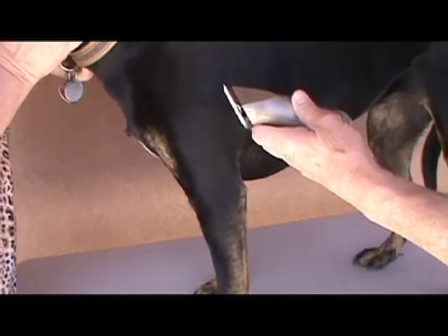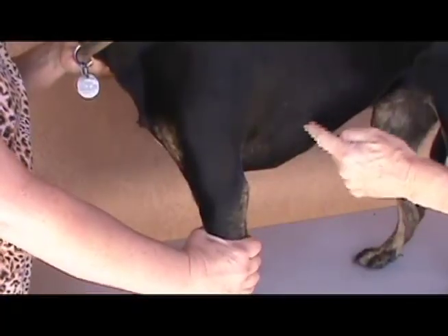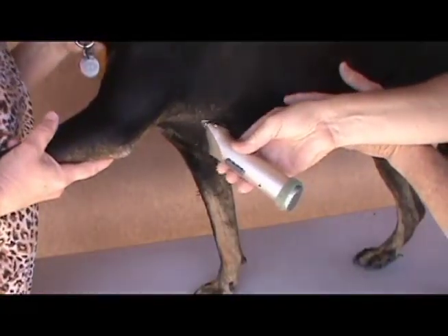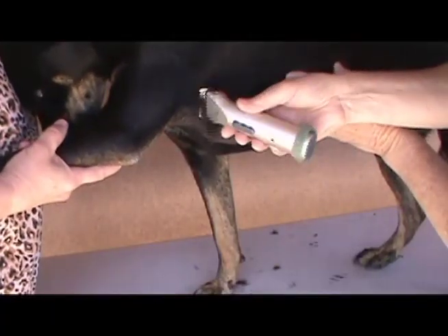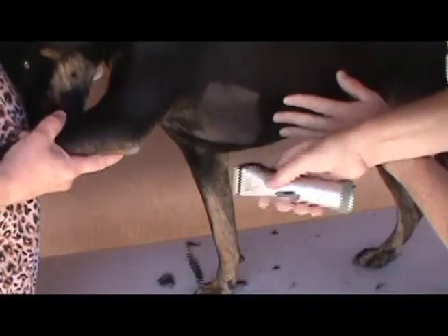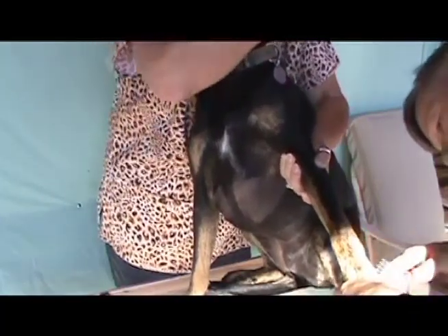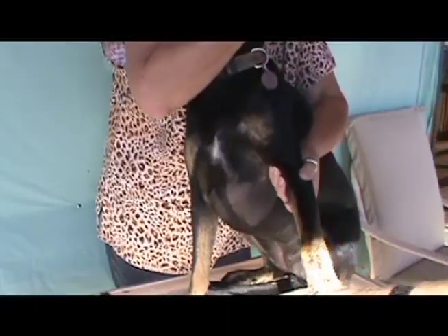It is usually best to shave hair from the area where the ultrasound transducer will be in contact with the patient's body. This is the lower third or half of the thorax, just caudal to the elbow on the right and left side of the thorax. You may want to place your hand over both sides of the chest to locate the pulsation of the heart. I also shave the patient's foot or tail for a blood pressure measurement. I usually obtain a blood pressure and then an ECG prior to the cardiac ultrasound.